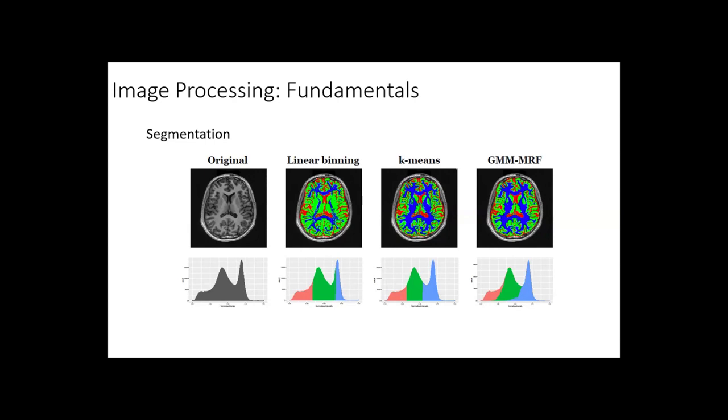Okay. We just add this phi on top of your energy function. So basically we try to encourage the smoothness, right? So let's say in this 2x2 neighborhood, the 3 are white matter, okay, and only this one is gray matter.